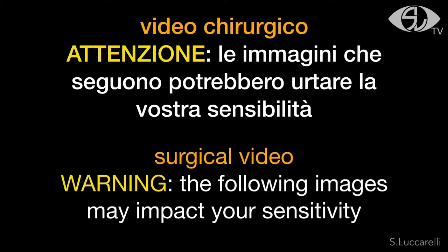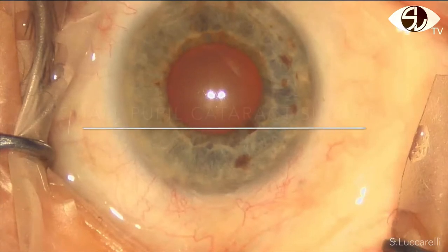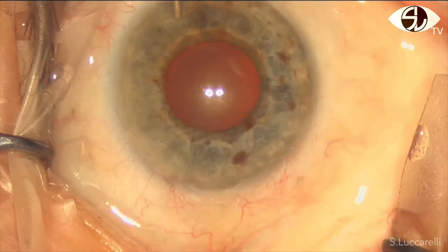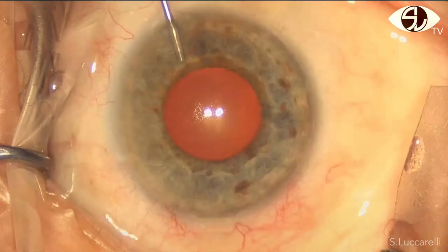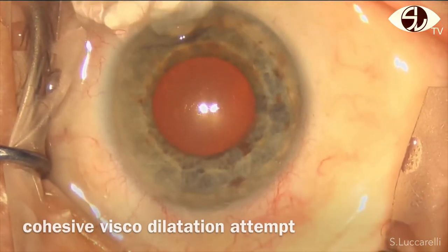Hi, I'm Saverio Lucarelli and I show you this video of a small pupil cataract surgery and mechanical dilatation with push-pull. I begin with cohesive visco injection in the anterior chamber, secondary incision and cohesive visco dilatation was attempted without any success.